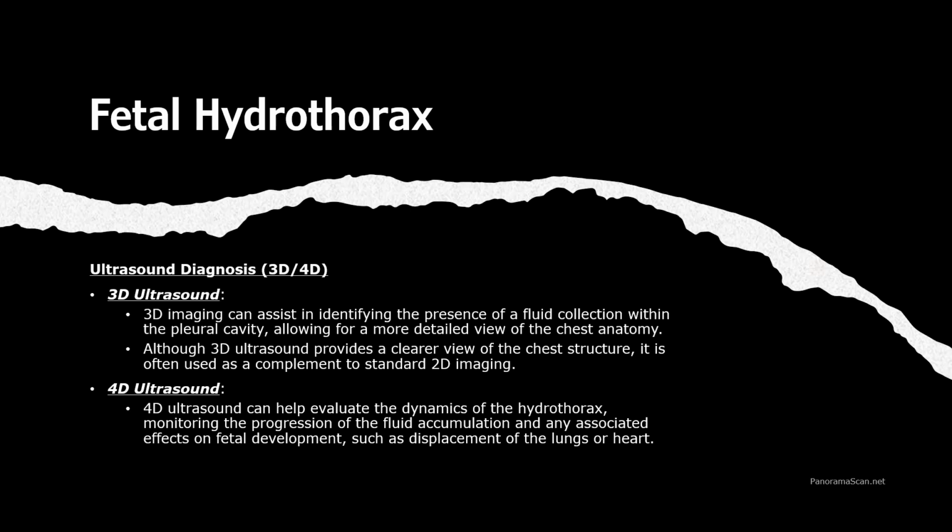4D, on the other hand, allows us to assess the dynamics of the condition, where we can monitor the progression of fluid accumulation over time and observe any associated effects on fetal development. For example, it helps in visualizing any displacement of the lungs or heart, which can be crucial for understanding the severity and potential impact of the hydrothorax on fetal well-being.